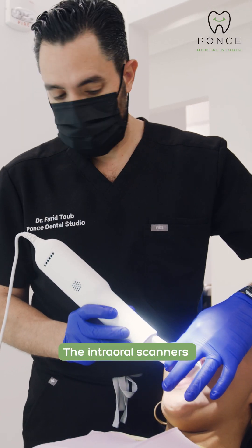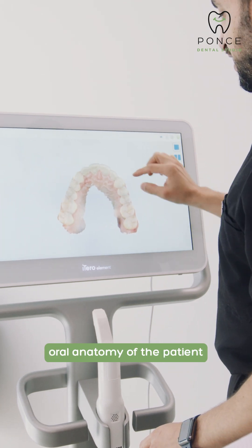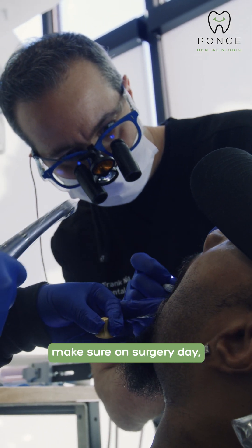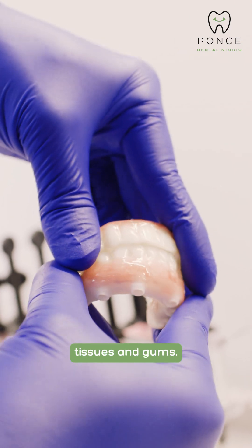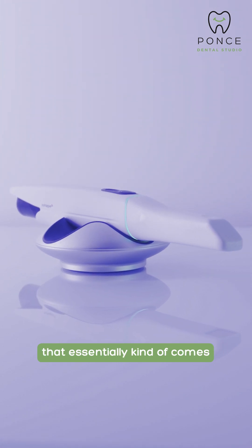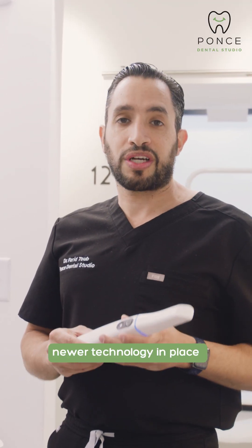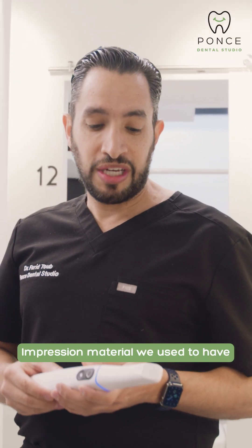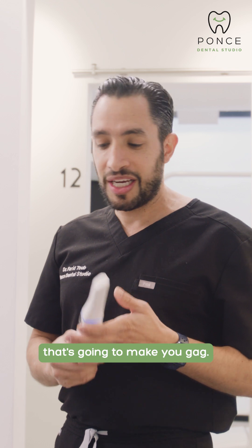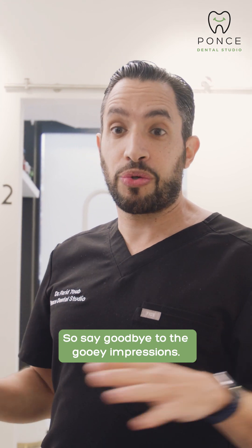The intraoral scanners that we have in the office are essentially what's going to allow us to see the entire oral anatomy of the patient and make sure all the soft tissues are in order. It also allows us to make sure on surgery day, whatever prosthesis you're getting is going to fit on all your soft tissues and gums. We have two different types of oral scanners in our office. We have a Trios device that comes with its own scanner. These are now used as a newer technology in place of the old gooey impression material we used to have. If you've ever had any dental work done in the past, you remember the gooey smelly impression material that's going to make you gag. Now we use these little devices that allow us to scan the entirety of your mouth. So say goodbye to the gooey impressions.